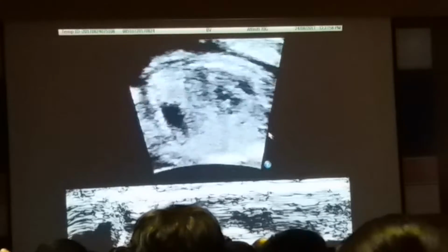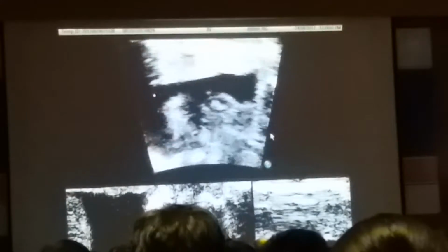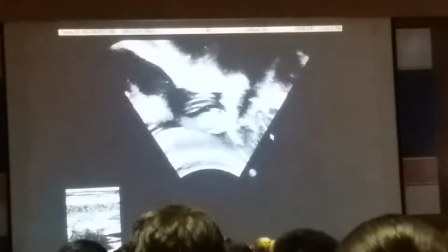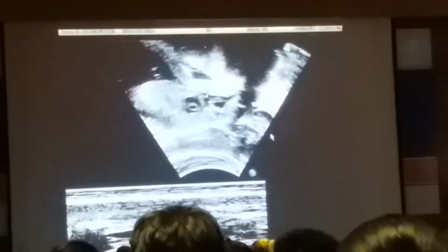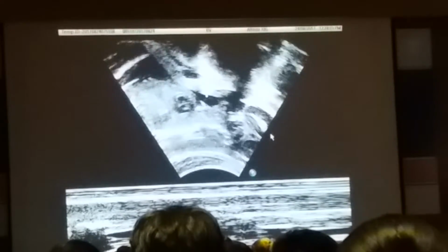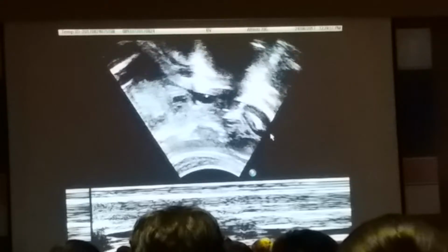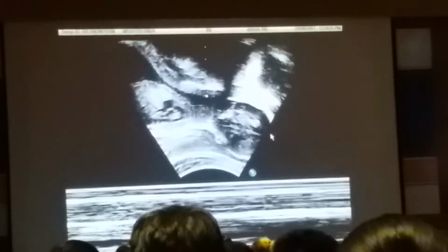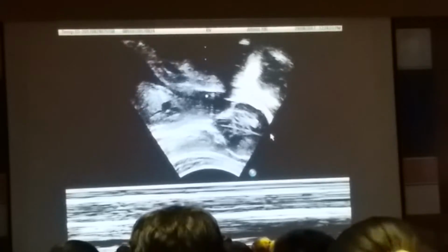Now, what I haven't really had much luck seeing, and I need to go closer to the head. So we're going to come out of zoom again, because you can't really zoom. You can't look and zoom. You have to unzoom it. Okay. There's the arch. There we go. Can you come here and help me, Mine?